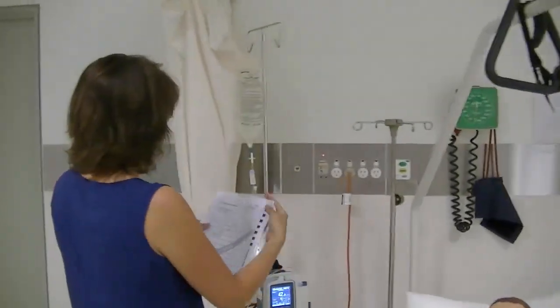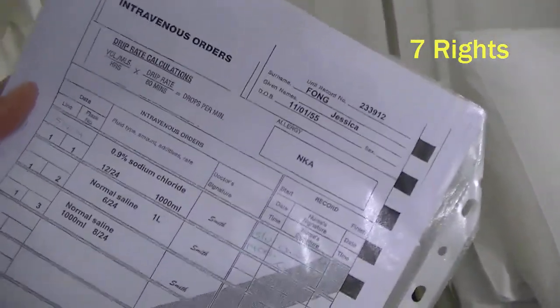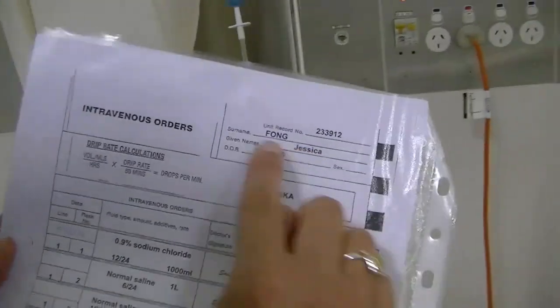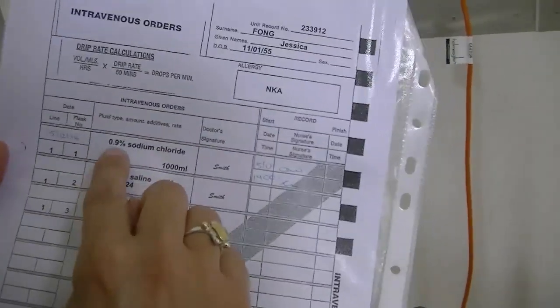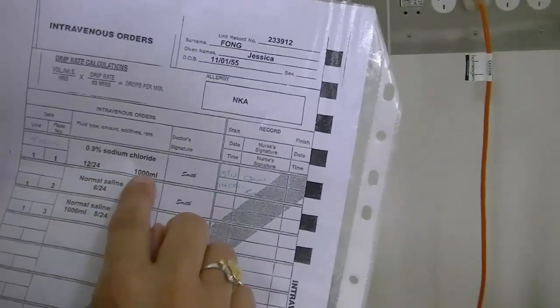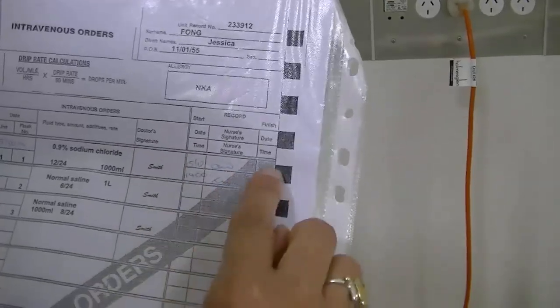So I'll go through the 7 rights. I've just checked her ID band, Jessica Fong, 11th of the 1st, 55, 233912, no allergies. And I'll run through name, IV order, flask number, 0.9% sodium chloride, 12 hourly, 1,000 mils, it's signed. I know this is the current flask because it's been commenced but it hasn't been finished or signed off finished.